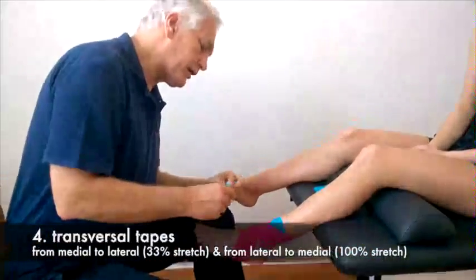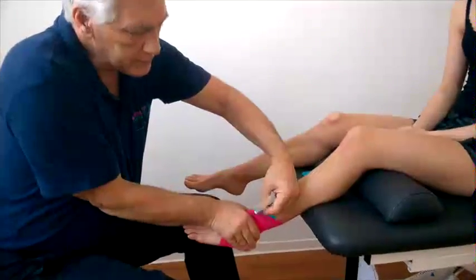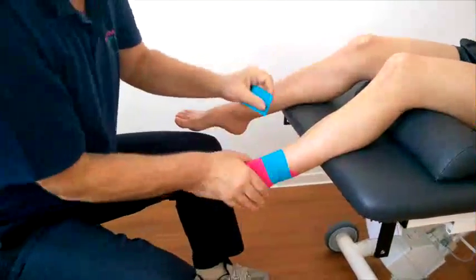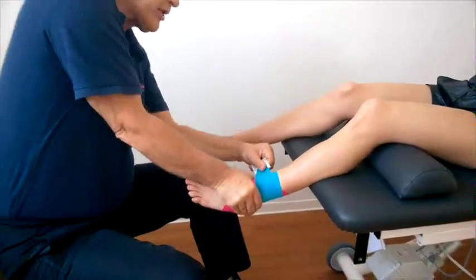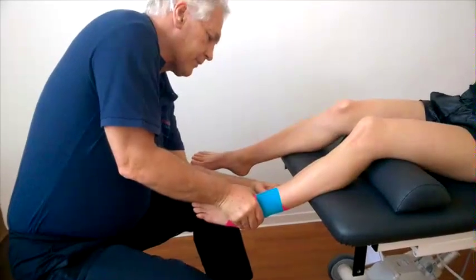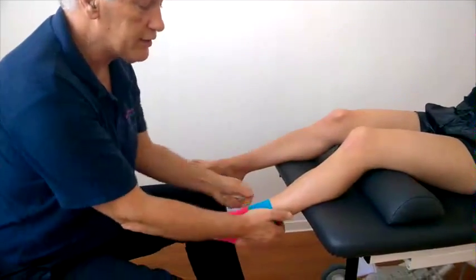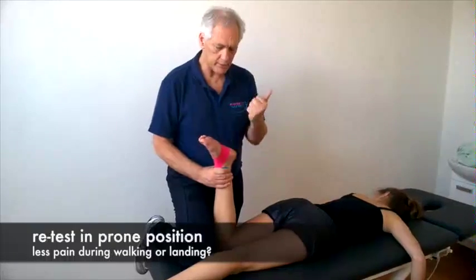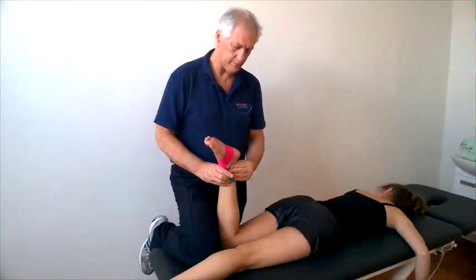Instead of applying more stretch, simply apply a second figure of eight, then do the transverse tape again. The elastic variation starts at the backside of the fibula and tibia, squeezing both bones together as you pull through to the backside of the fibula. If necessary, apply the last transverse tape with full stretch again — shortened by one-third as measured — squeezing together and pulling simultaneously. As you can see at the backside of the leg, the Achilles tendon is free, so we don't interfere with the function of the triceps. Testing by slamming without compression, there should now be less pain due to the tape application, and the patient can walk normally without pain.